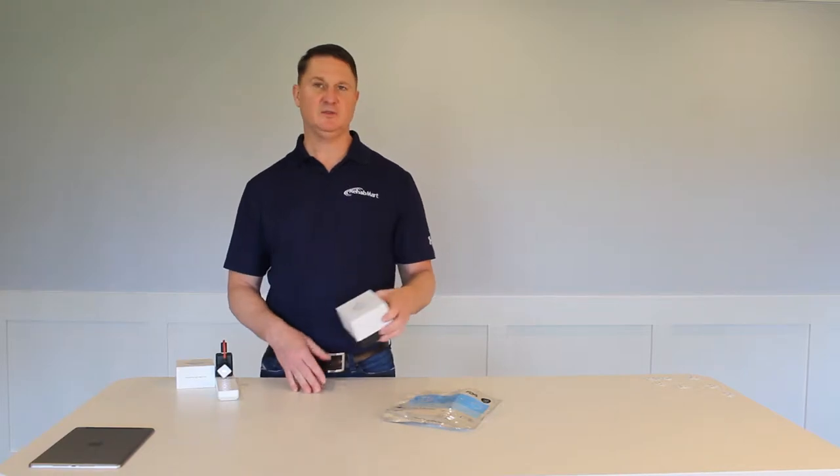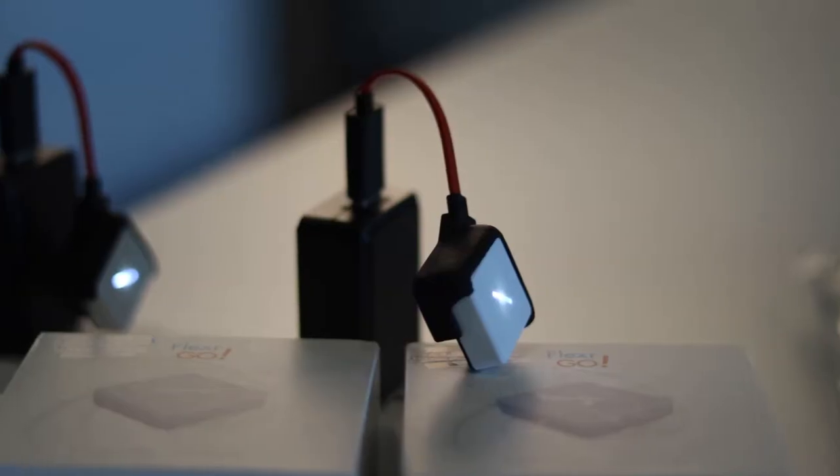I'm Hewlett Smith, an occupational therapist and also the co-founder and CEO of Rehab Mart. I'm here today to demonstrate a new product called the FlexrGO.